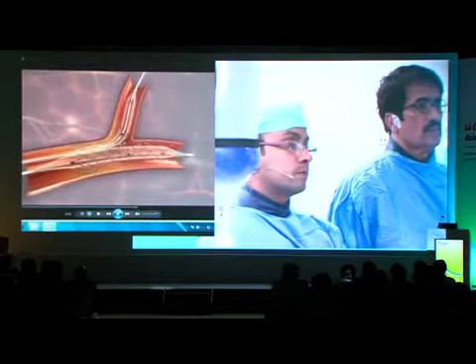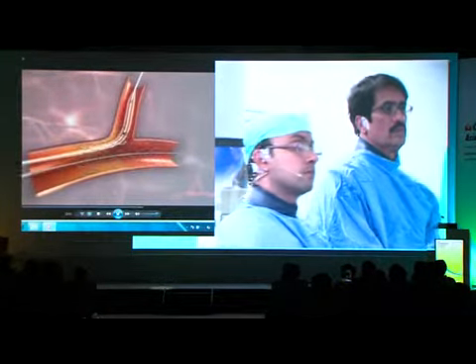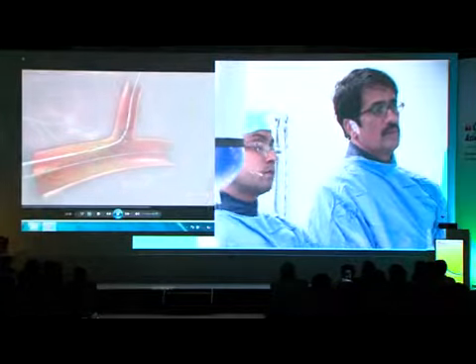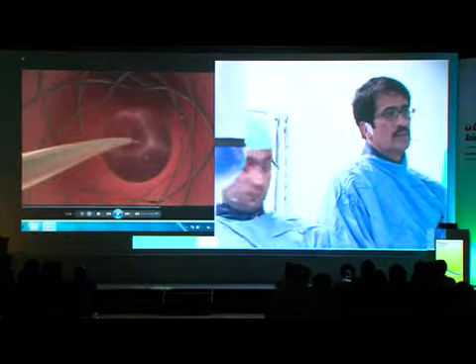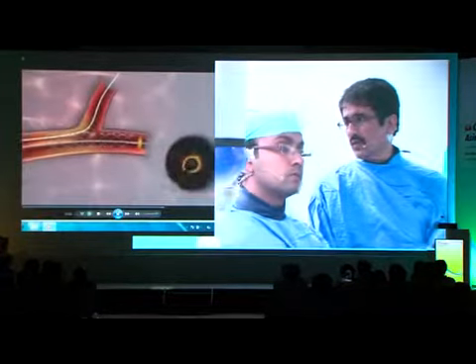See those struts which are going into the diagonal? They may be enough for an ostial. You have a long ostial diagonal. Sometimes you can manage with only one stent.